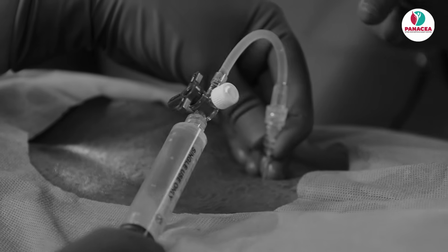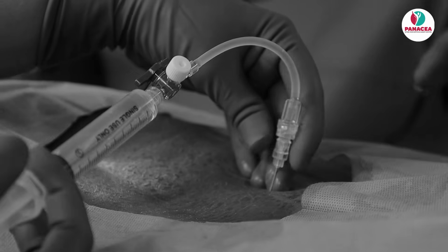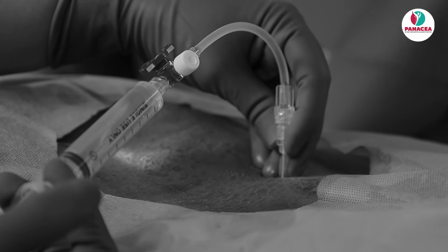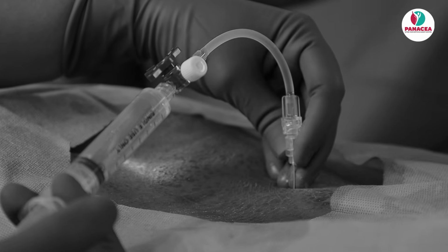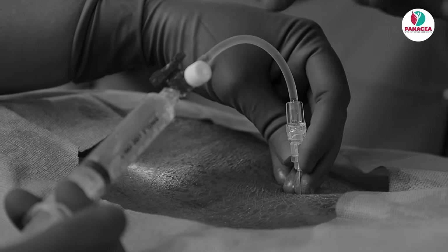Now you see we are injecting normal saline 5 to 10 cc in order to flush away all the inflammatory mediators, the chemical mediators which are generated because of the disc herniation. The nucleus pulposus is a foreign body, it amounts to a lot of inflammation. We are flushing away all the inflammatory mediators with the help of normal saline. It is being injected through an extension line.